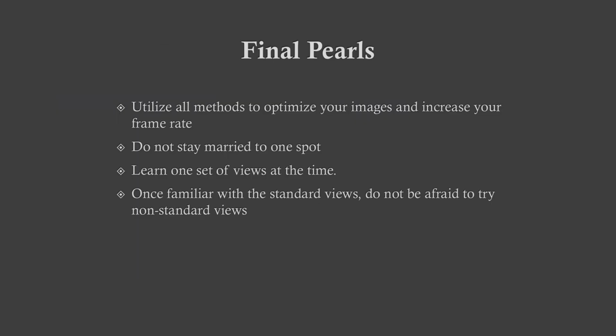Just to wrap up, we'll go over some final pearls. Utilize all methods to optimize your images and increase your frame rate. Do not stay married to one spot. Learn one set of views at a time, and once you get familiar with the standard views, do not be afraid to try non-standard views.